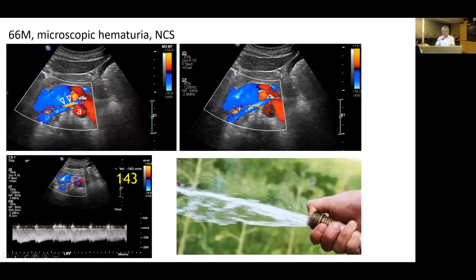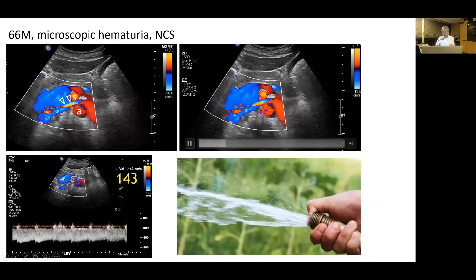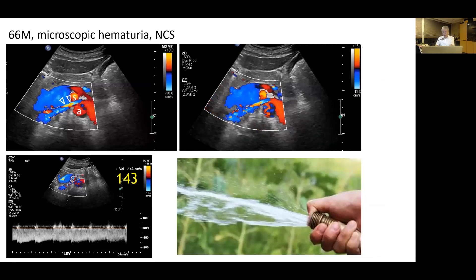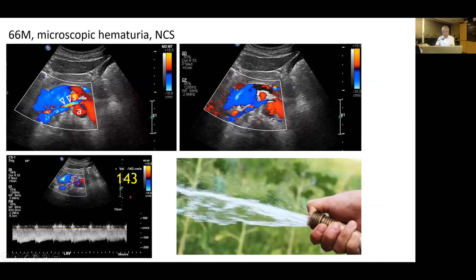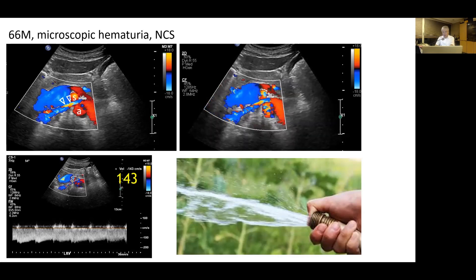A 66-year-old man with microscopic hematuria due to Nutcracker syndrome: color Doppler ultrasound well shows bright colored jetting from the compressed aorto-mesenteric left renal vein, and the peak flow velocity is 143 cm/s. We can make a diagnosis of Nutcracker syndrome without invasive catheterization.